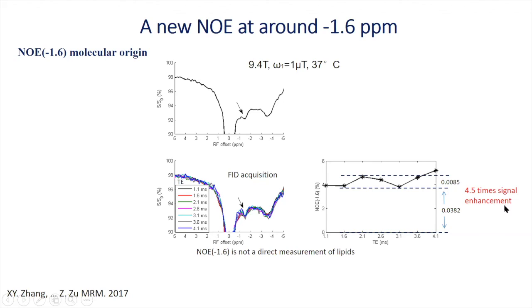Also, I think most importantly that the NOE can measure not only the choline head group concentration, but the coupling rate, which we think should be related to physiological conditions. This is similar to the APT imaging of the protein peptide content and pH.